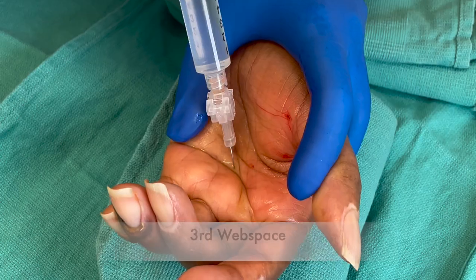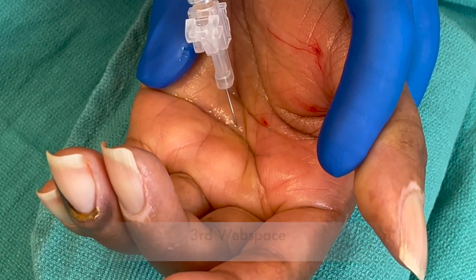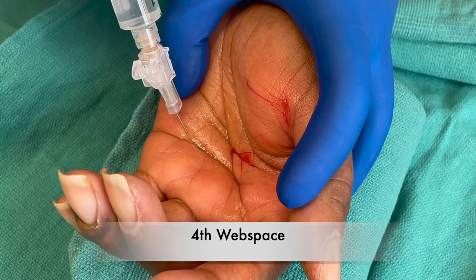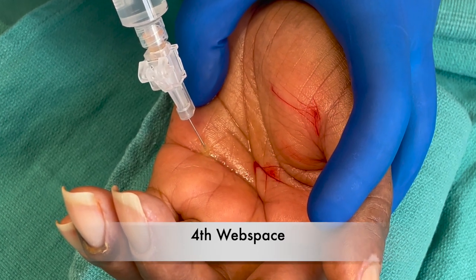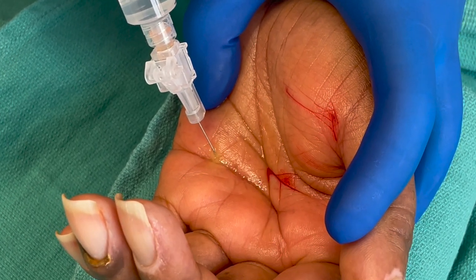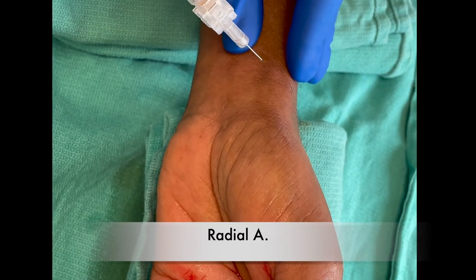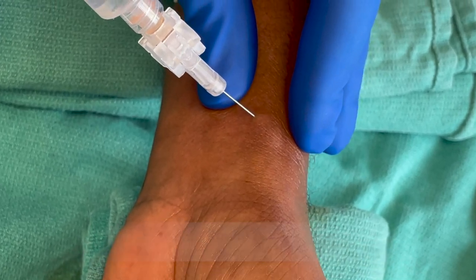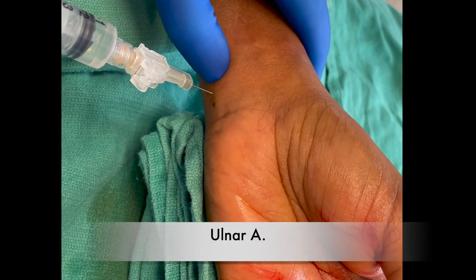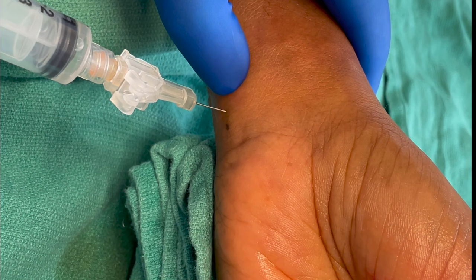Most patients tolerate the injection, but it can be quite painful. Consider topical lidocaine or even a lidocaine wrist block prior to injection. Avoid ethyl chloride for skin anesthesia, as this can exacerbate symptoms. Radial and ulnar arteries receive 2 cc's each. Palpate for a pulse if present, and aspirate prior to injecting.